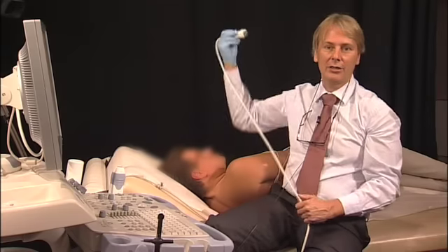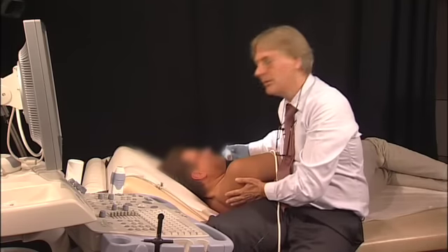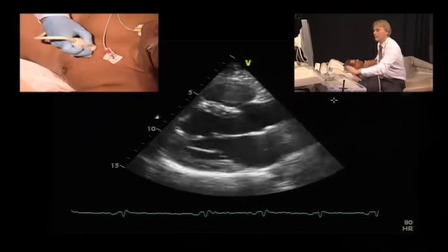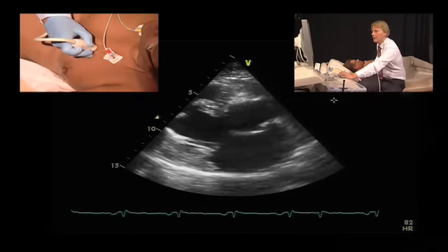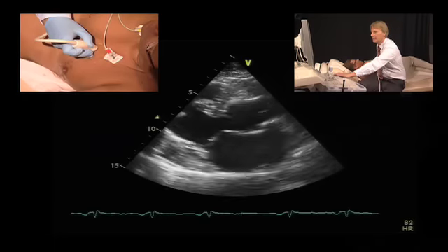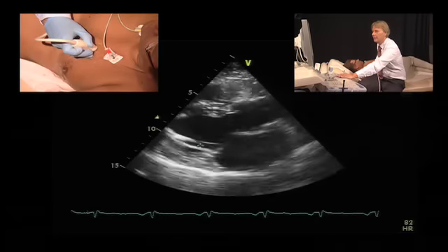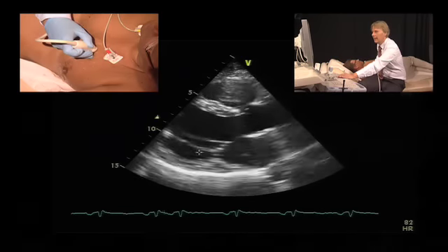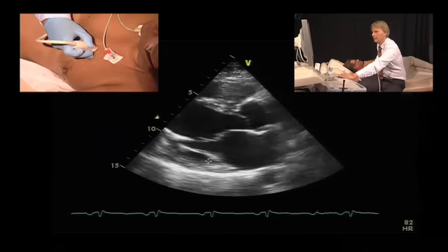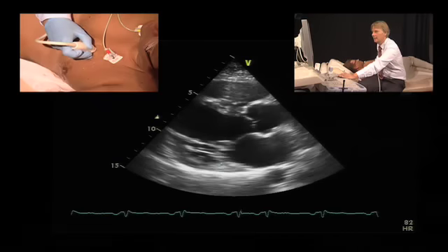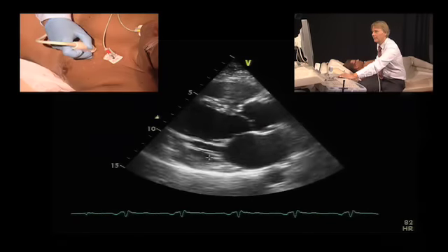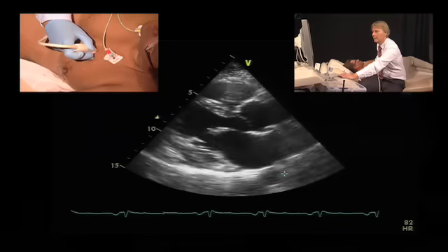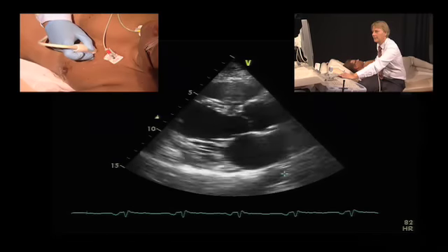This is the patient with endomyocardial fibrosis, and I will now show you the typical features that we can find in such patients. In the parasternal long axis view, we can appreciate that there is fibrosis of the subvalvular apparatus, which extends here into the papillary muscle and also into the posterior mitral leaflet. You can see that the posterior leaflet is restricted in its motion, and we can expect at least some degree of mitral regurgitation in this patient.